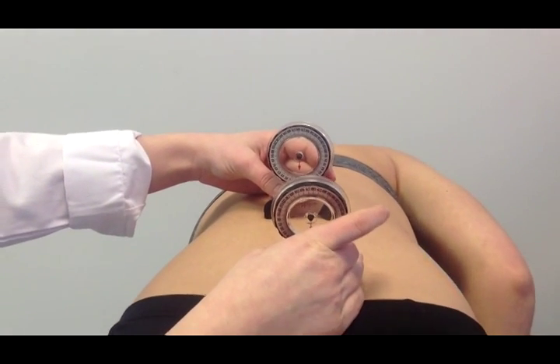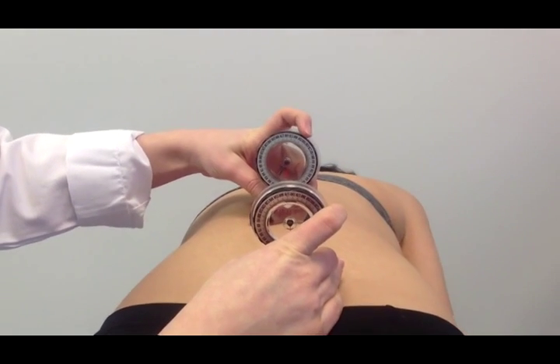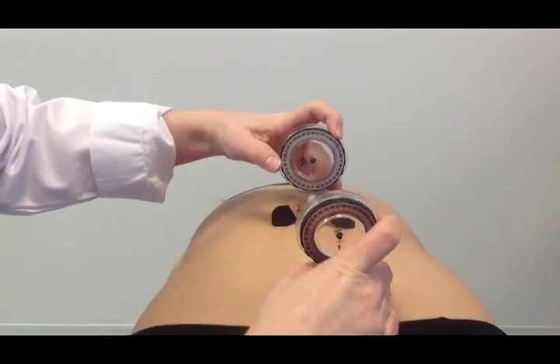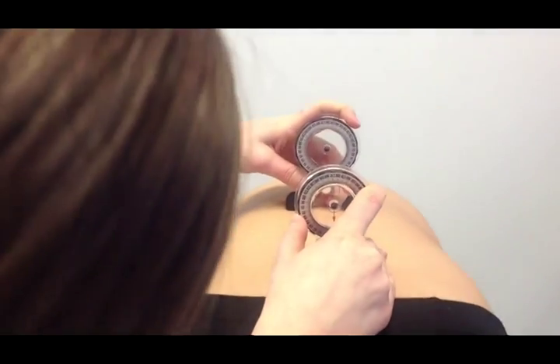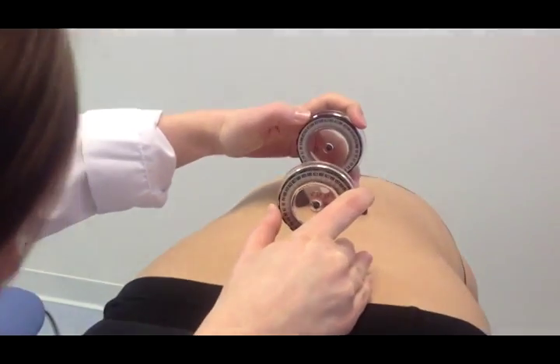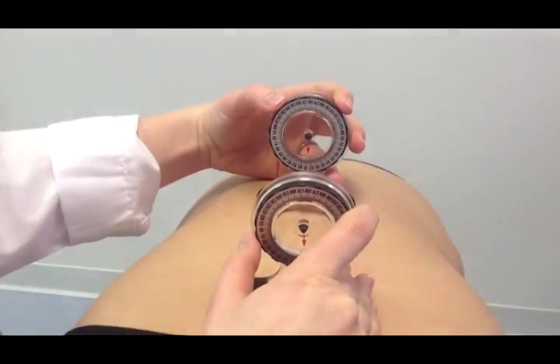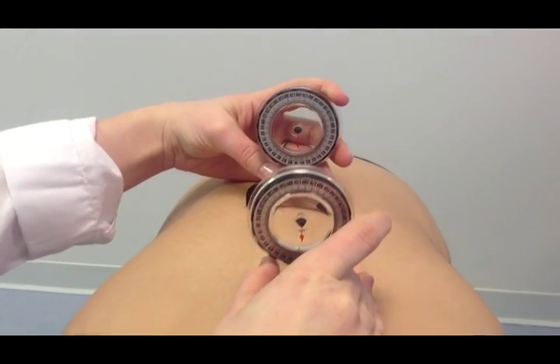Mallory, you can go ahead and move your shoulders back to the start position. I'm going to re-zero my inclinometers before I look at the other side of Mallory's lumbar rotation.